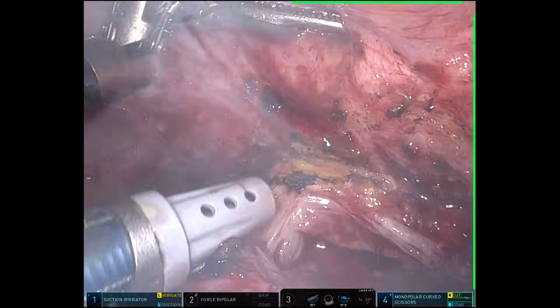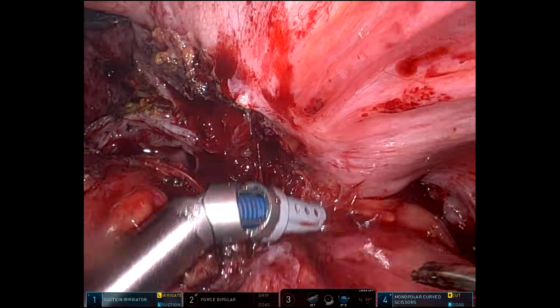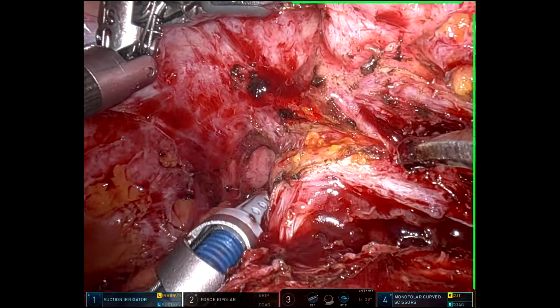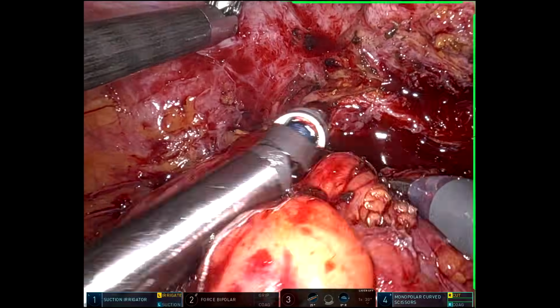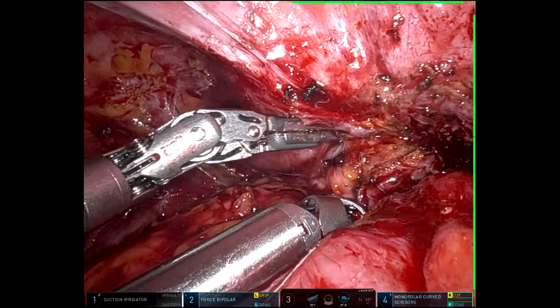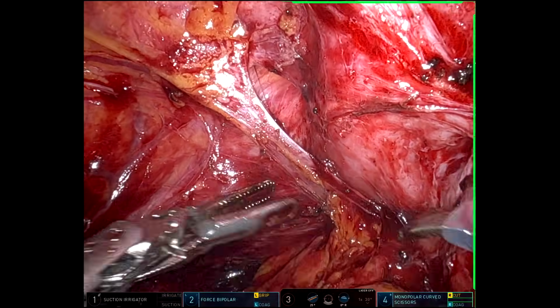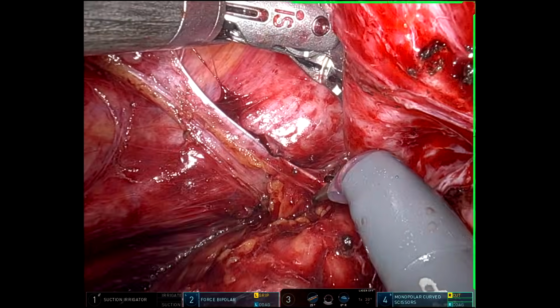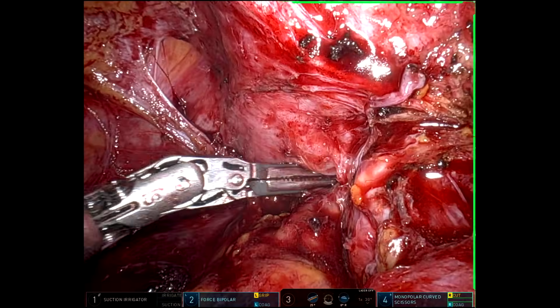You can see there I've actually split the colon open at the level of the fistula, so I have to carve back into the plane here between the wall and the bladder. Trying to bluntly separate that. Pointing out the uterus, bladder, and ureter down there.